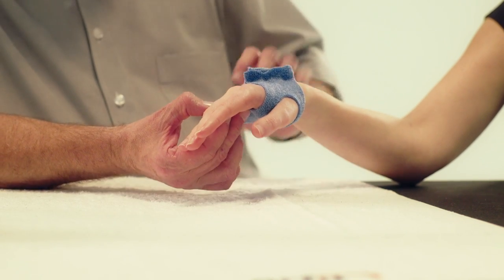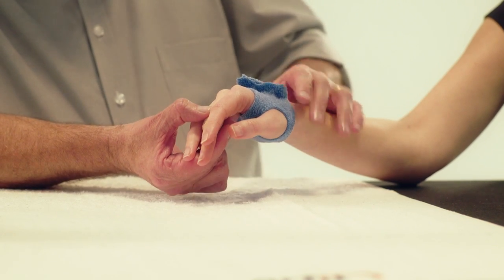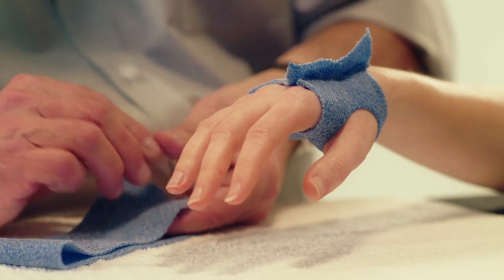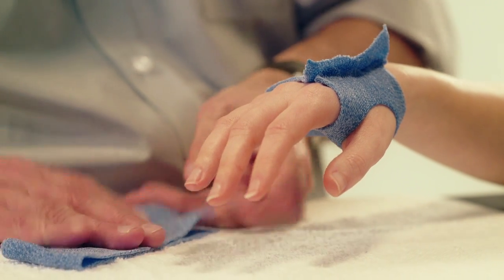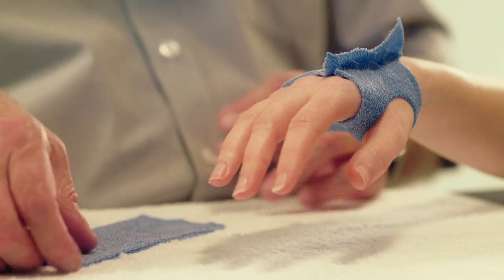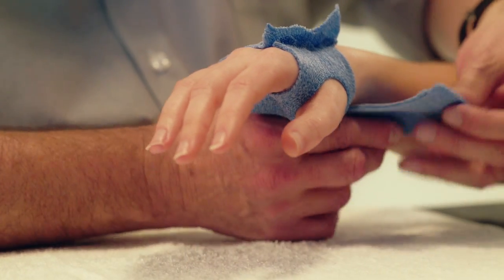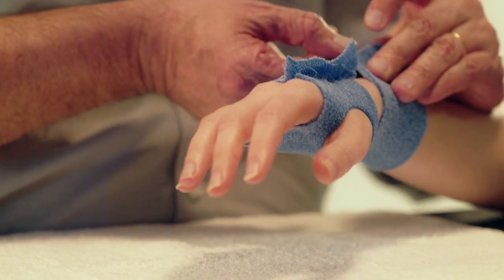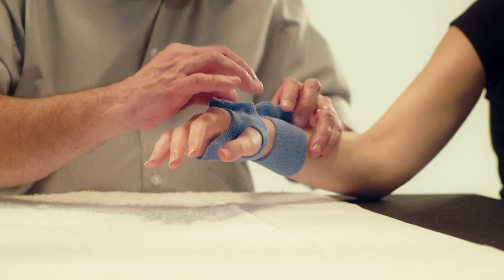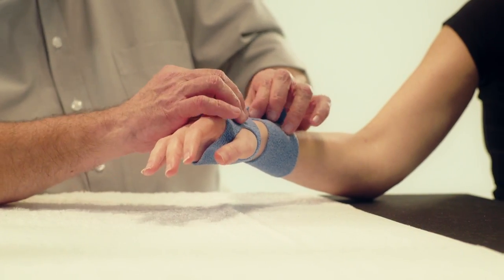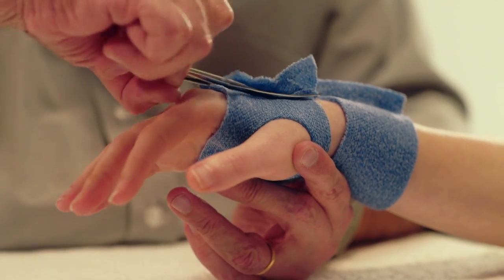Carefully mold the hand arches with a pressure point underneath the head of the third MCP. Take the second strip of Orphicast, fold it in half and wrap it around the distal part of the forearm. Pinch it together on the dorsal surface of the forearm.